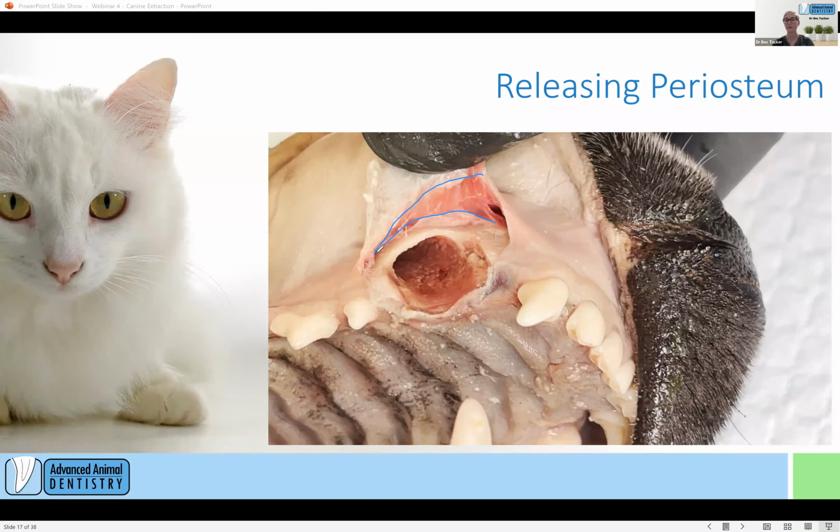You can also use those Lagrange scissors that we spoke about before. They're beautiful, and I would probably use them on all dogs now. I don't use them on cats because they're scary. Essentially, at the corner of the flap, introduce the tips of those scissors, gently open them, and you can see it here where I haven't completely resected through this tissue. You insert the tip of your scissors and gently slide it in and along. You can just open the blades and spread that tissue. I always look at the back of my flap to make sure that it's not penetrating through, and then you can cut, and that gives you a really clean cut. You can continue to do that more and more to get more release.